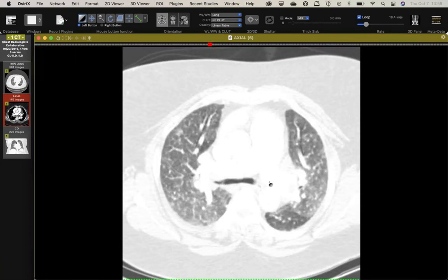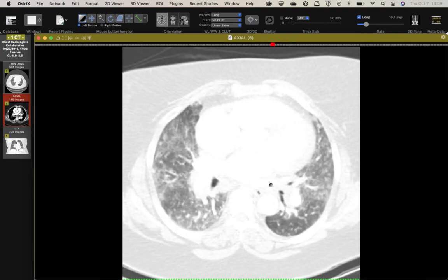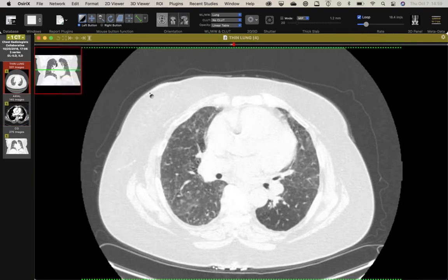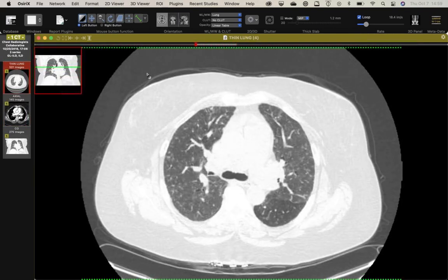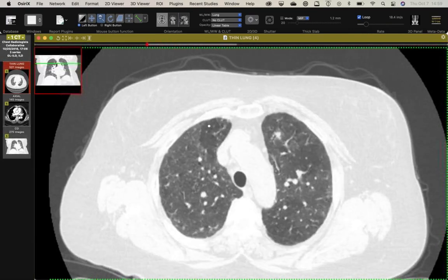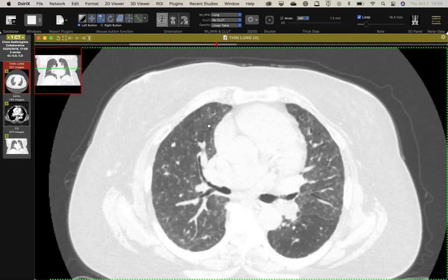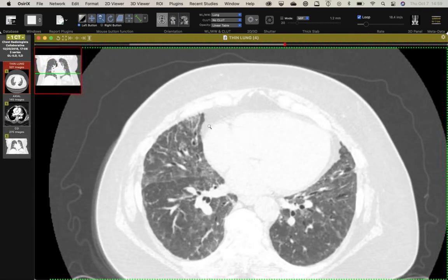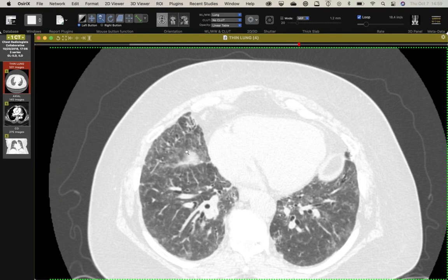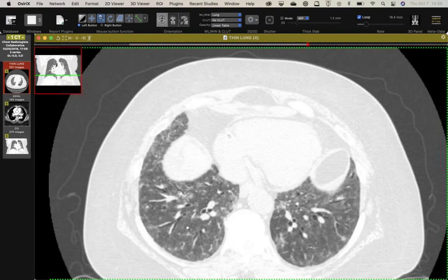I don't know what the pathologists like to call it now. I know they don't particularly like that term, but that's what we have. And this patient was treated over the years with IVIG. So this was a follow-up scan, and you can see that the lungs have changed in their appearance. The pulmonary hypertension is still there, but the nodules have waned quite a bit. Down low, there's almost a fibrotic appearance. You see some ground glass, a little bit of reticulation, some traction bronchiectasis.